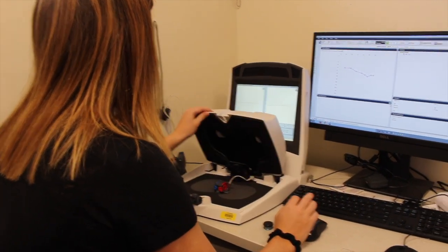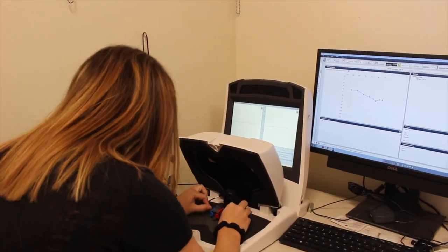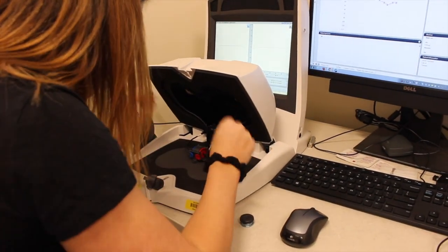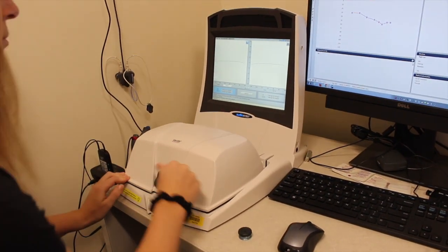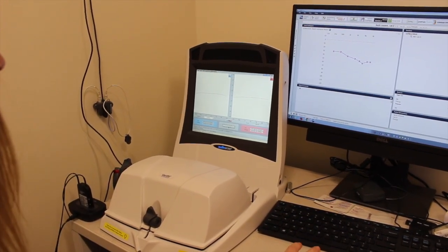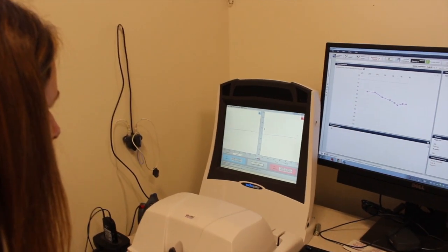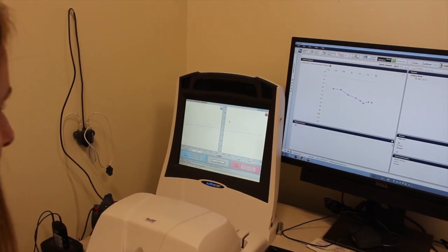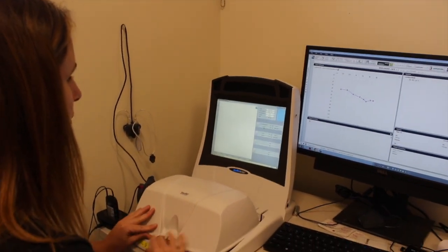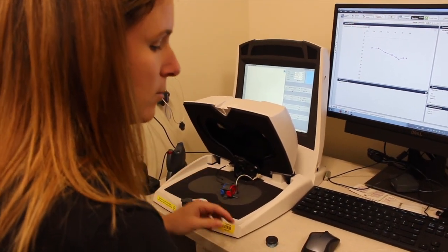It is possible to generate simultaneous frequency response output curves for 2 input signals that are presented simultaneously from different directions. By orienting the hearing aid microphone ports in the test box so that one of the input signal speakers is front-facing, 0 degrees azimuth, the other speaker will then occupy a secondary or jamming input signal orientation. Thus, directionality can be tested. Next, we selected directionality in the test box on the VeriFit in order to test the directional microphones.